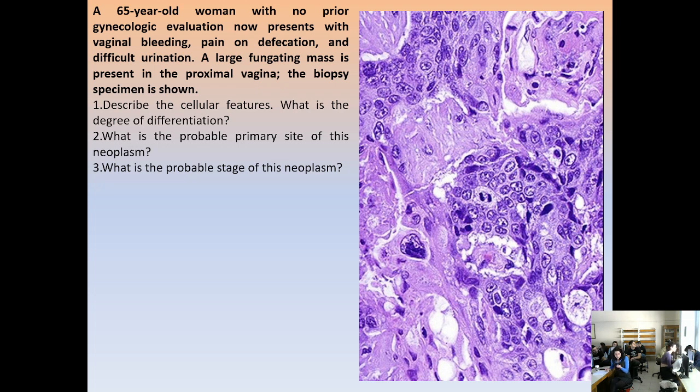Given this image, for example, what do you see here? You see this one? What's the nucleus like in that center cell? You see it has split into two. If the nucleus splits in two pieces, what is this called? A lymphocyte. It could be a lymphocyte, it could be any cell. If we have the nucleus of a cell and it splits in two, what is this?